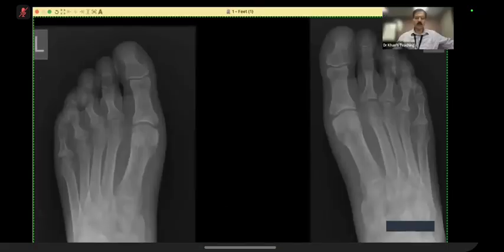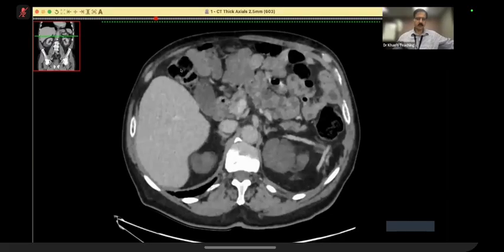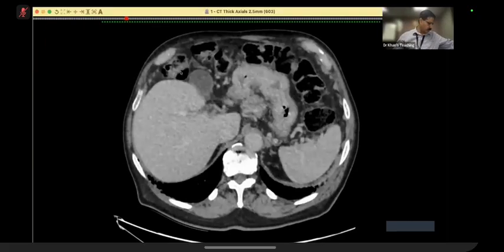Thank you, candidate 3. Candidate 4, are you with us? Yes, sir, I'm here. Okay, candidate 4. 81-year-old female, vague abdominal symptoms including vague pain, flatulence, etc. So they had done CT abdomen and ruled out any cause, any obstruction, any diverticulitis. Vague symptoms, vague request. Over to you.